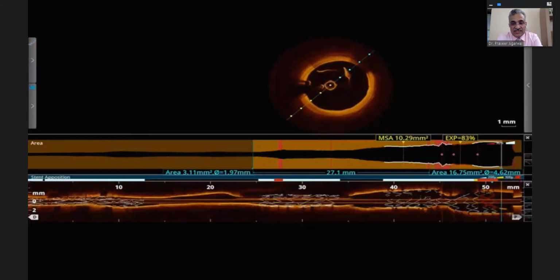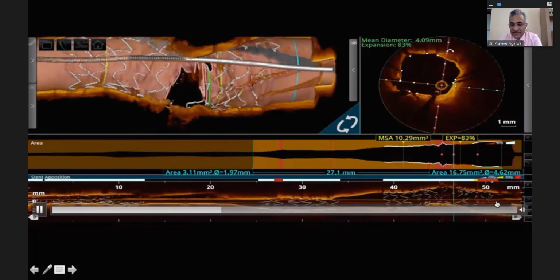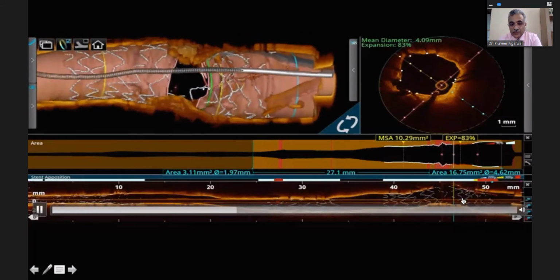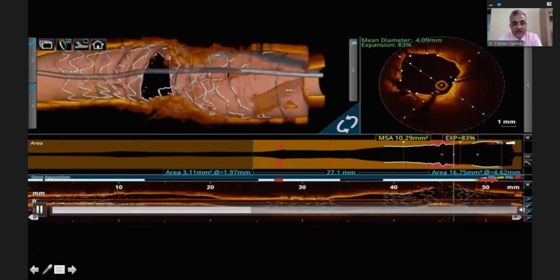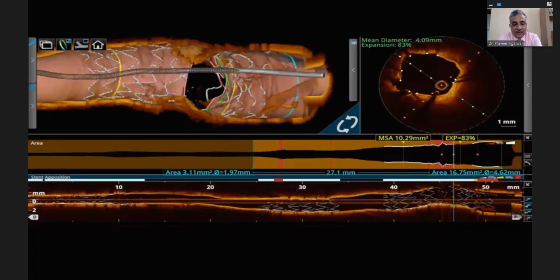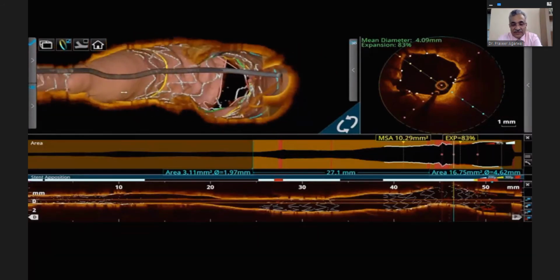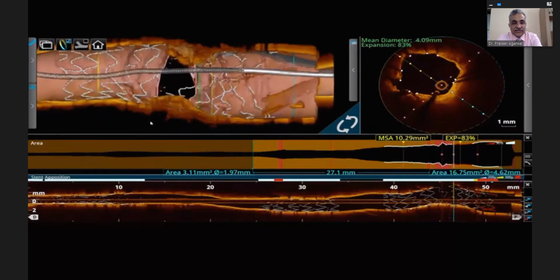Now see the proximal section. You can clearly see here, the stent is underexpanded, despite us doing a 5 balloon till this point. But to our surprise, with a 5 mm balloon at maybe about 16 or 18 atmospheres, the stent has broken across the circumflex ostium.